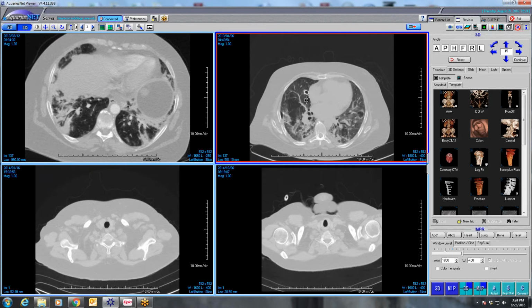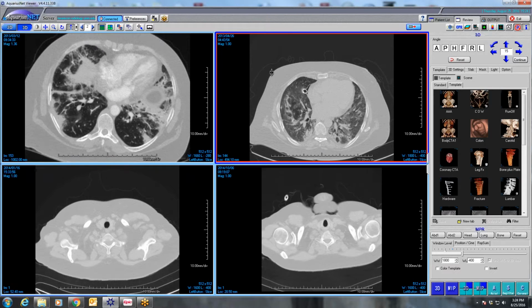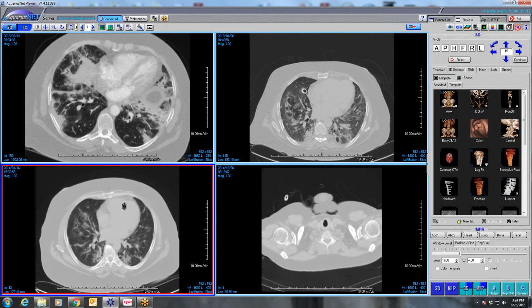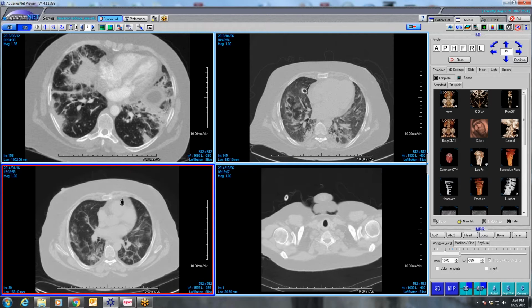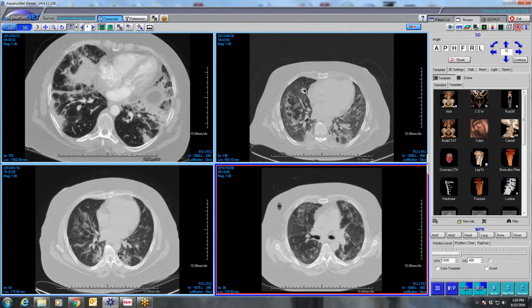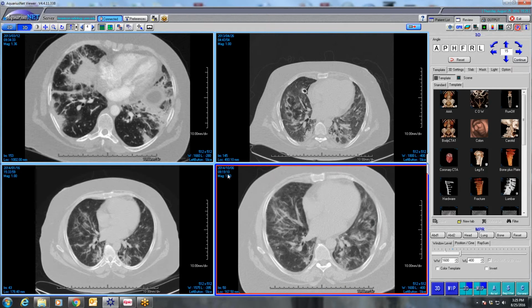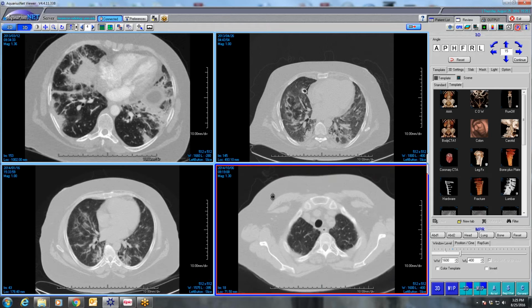This is her pneumothorax and chest tube post-biopsy. They treated her with high-dose steroids. We can see that some of the peripheral consolidation is melting away, but we still have this diffuse ground glass. This is only a few weeks later. Biopsy shows organizing pneumonia. Just to show the progression, they treated her with high-dose steroids, and then it wasn't working that well, so they added CellCept, and it's getting a little better. But then I'll go to the final study showing this diffuse pattern of fibrosis, and I have another study I'm trying to get from 2015, which shows that it's even worse.